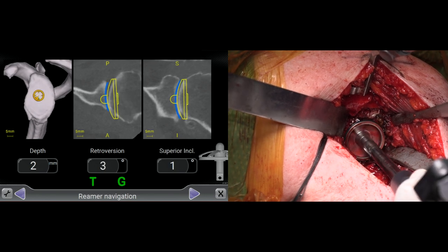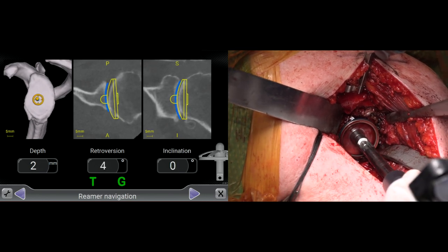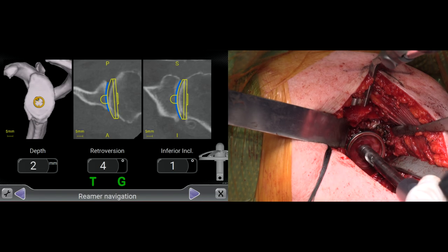Using intraoperative computer-assisted navigation assists in determination of the entry point at the surface of the glenoid to allow accurate reaming, resulting in a better version of the glenoid, as well as a lower range of error for implant insertion, specifically for version and inclination. The disadvantages of this technique would be a slightly increased operative time, which is dedicated to installing the sensor and acquiring the reference points with the tracker on the glenoid.